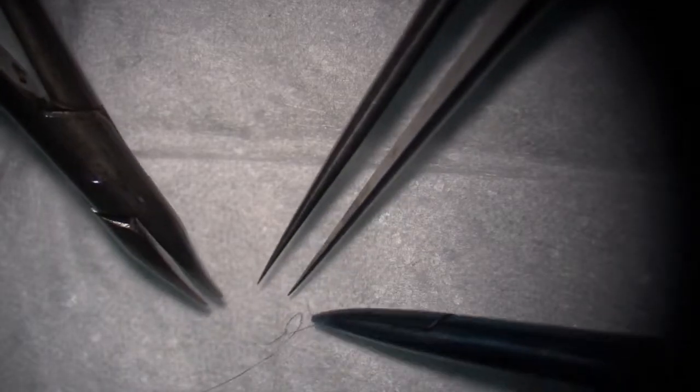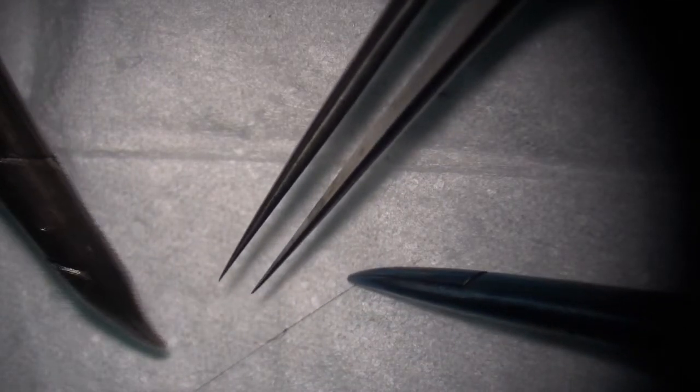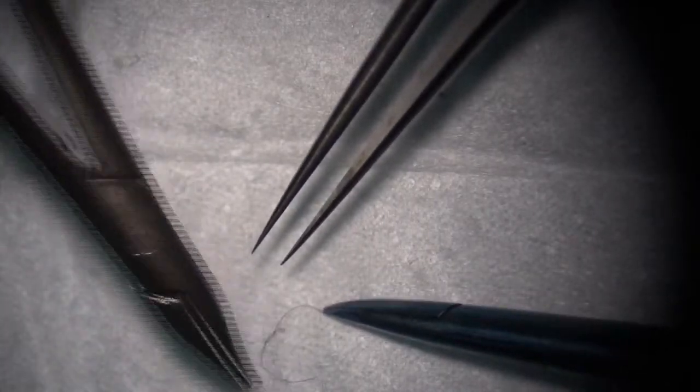You can point your needle holder pointing down. That's a little bit easier to pick up the suture. Nice. We got there, and then I'm going to bring this back into view. Yeah. Create this side. Now you see it's a little bit hard to make loops.